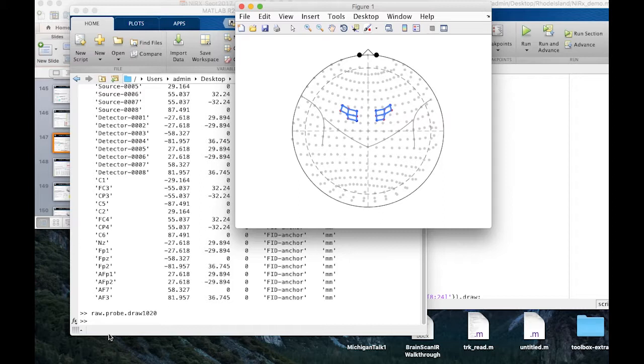Now this is the problem that's occurring with my data. The data Thomas gave me, NIRX has changed something with their data format, and so my registrations are not interpreting it right, and hence my motor cortex is appearing way too small and too far forward, and that's what's causing the issues right here, and I'm going to fix it. Just give me a plane ride home to Pittsburgh.